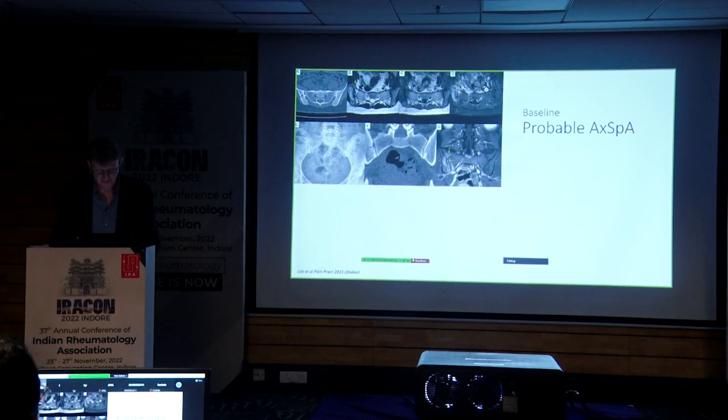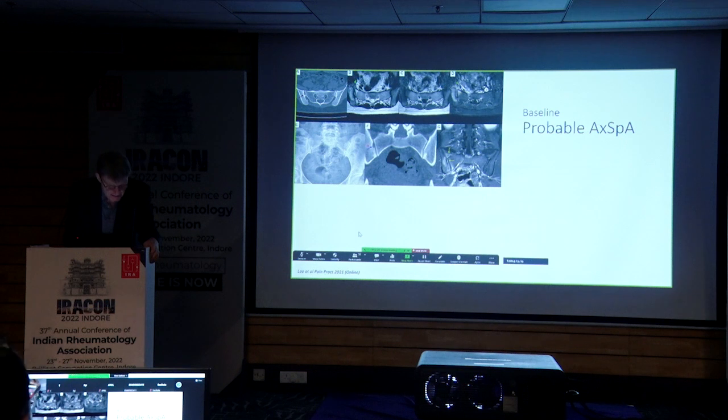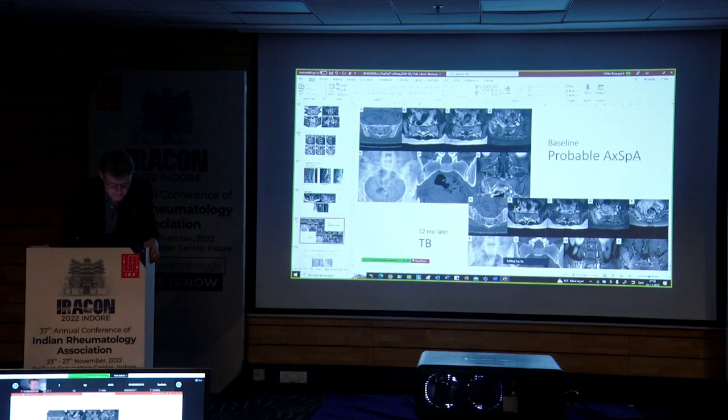Yeah. Now it starts making things here again. That's because I copied it in now because of the question. But the interesting thing is, if you look there where the red button, just stop this and do like this instead. That's better, and then we'll make it a bit larger.